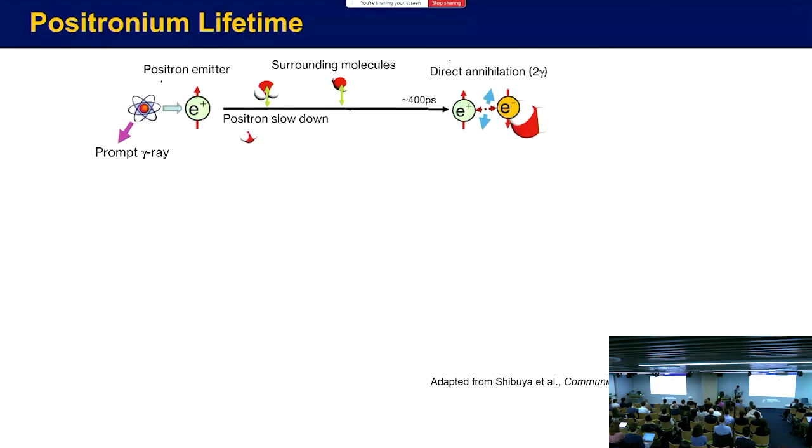As we all know, in PET we inject a radioactive tracer into the patient, and it emits positrons. My initial understanding was that the positron, the antimatter of the electron, annihilates with a nearby electron, producing two 511 keV photons. That's how we detect the signal and reconstruct the tracer activity distribution inside the body. But it turned out this is not the complete picture.